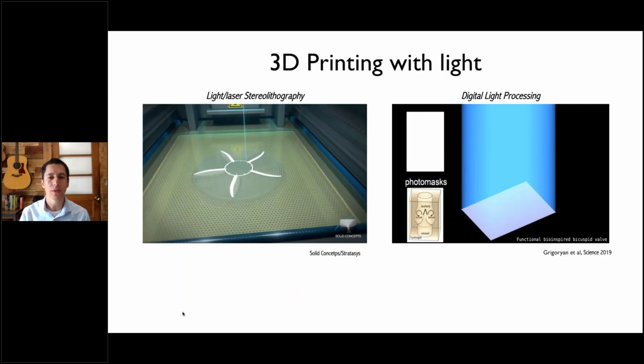So just going into the details of the aspects of 3D printing that are more relevant to dentistry. I brought 2 different aspects here that are not your typical extrusion printing. One is the stereolithography that Kurt just presented nicely.